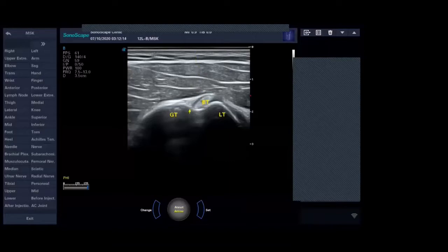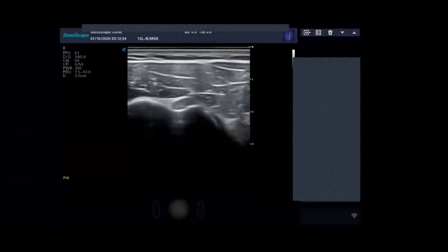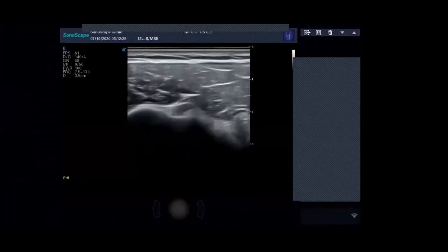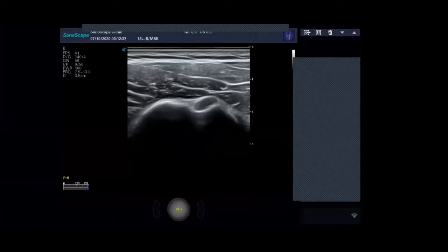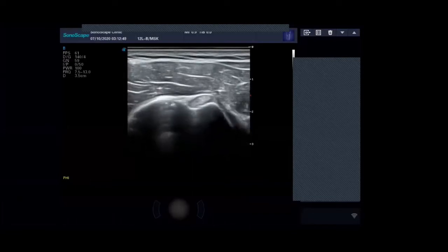Okay. Now, hopefully if I clear all those out. Okay. So, yeah, the biceps tendon is in the groove there nicely. The trouble with the biceps tendon is you can very quickly make it look black. If I freeze that, can you see how it looks black? That would be tendinosis if I hadn't optimized my scanning technique. So essentially it's not tendinosis, it's just because of my angle. So if I tilt down, you see how that brightens up?